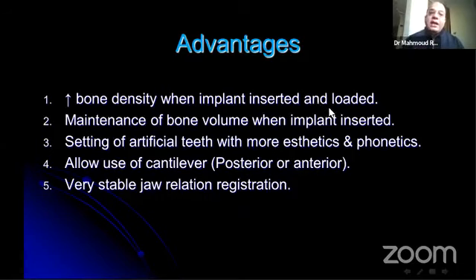This tension will lead to maintaining the bone. The implant also has the same role as the periodontal ligaments, but less. We have some bone resorption around the implant. Even if you make it perfect, you may also have some bone resorption around it.